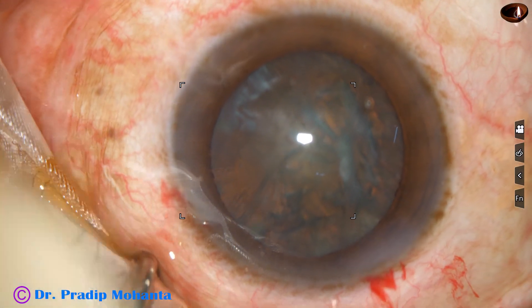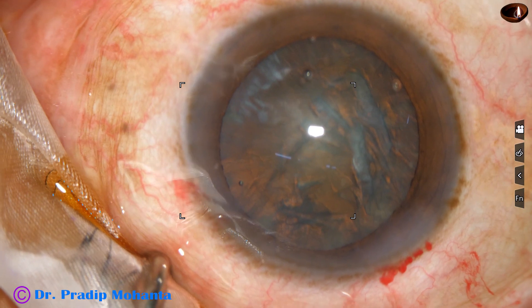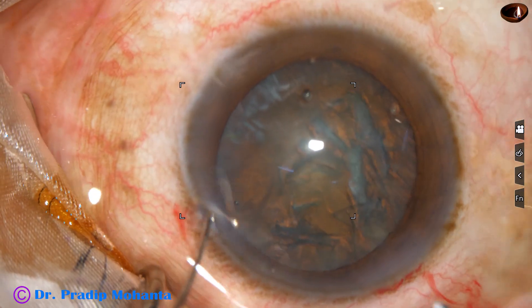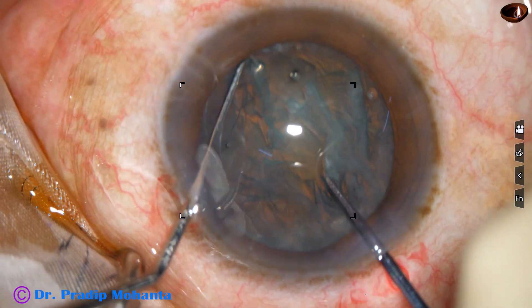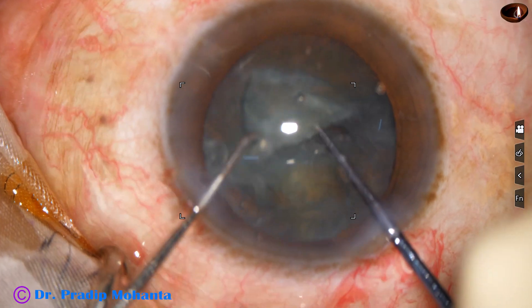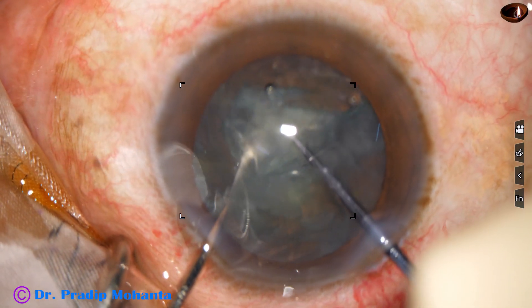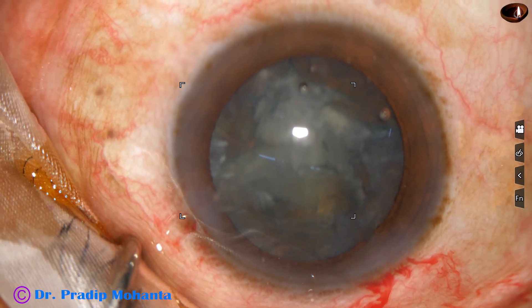In this case, by this time we have made the incisions, have done rhexis, have done hydrodissection and rotated the nucleus. Now here goes the pre-chopper — this is real speed. The pre-chopper and the sustainer just divide the nucleus into two hemi-nuclei in a few seconds. Then one hemi-nucleus is divided into two fragments in another few seconds.